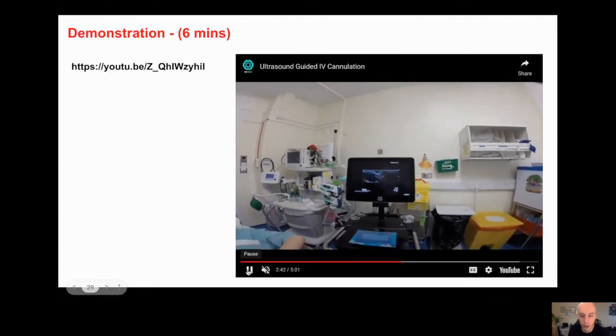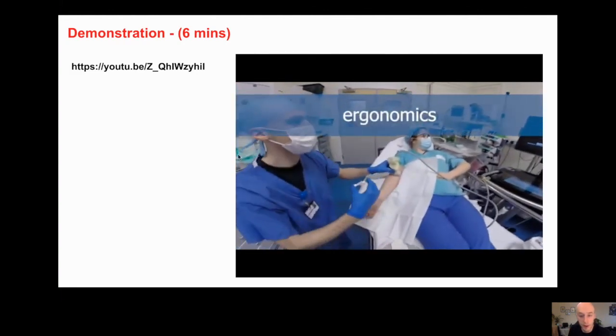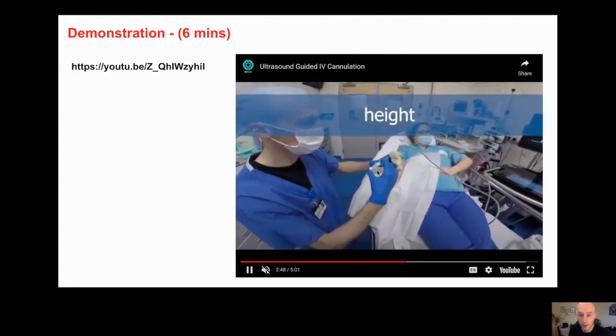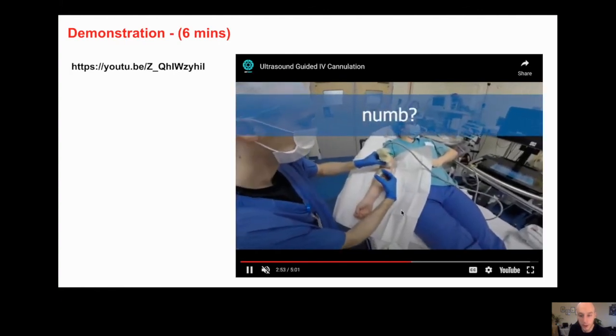Just a word about ergonomics. So not practicing what I'm preaching here, really this machine should be over here in line with Sophie's arm. But I am making myself comfortable by getting down to the right height, and I'm also talking about moving the screen, just checking that she's numb.